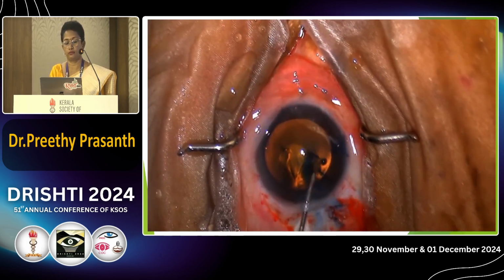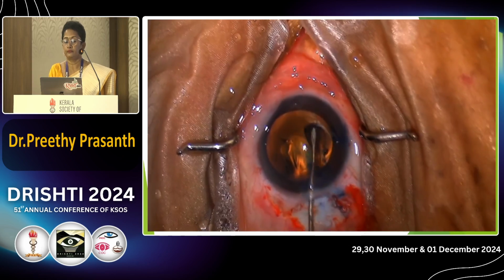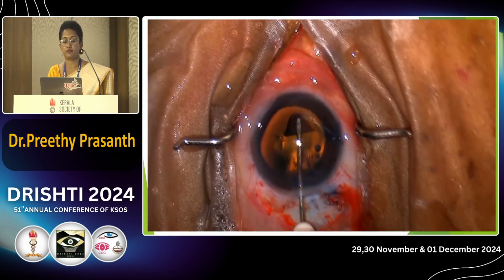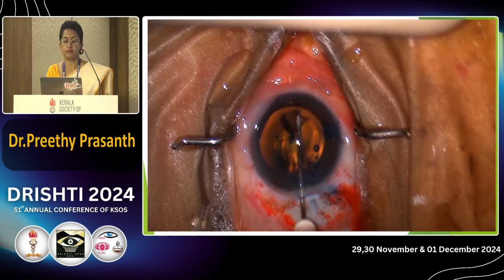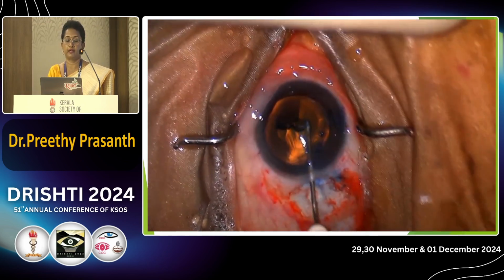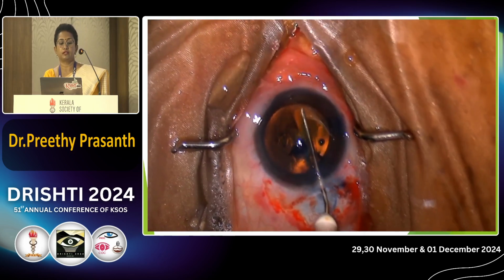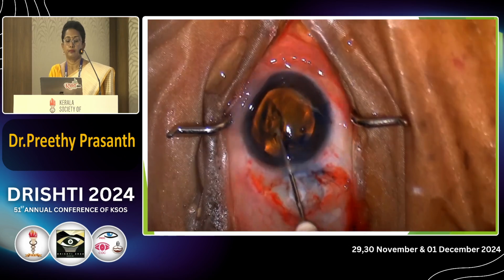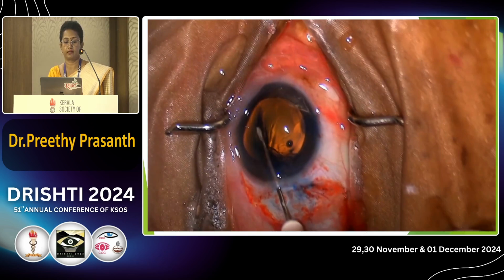Care should be taken that you don't over inject and overfill the anterior chamber so that iris can prolapse. Then while making the flap, take care to see that the flap is always flat on the anterior surface of the lens, and start by doing around 6 mm diameter capsular rhexis. You can make it smaller or bigger depending on the size of the nucleus. Once the rhexis is complete, again the cystitome is taken out exactly sideways so that you don't damage the endothelium.